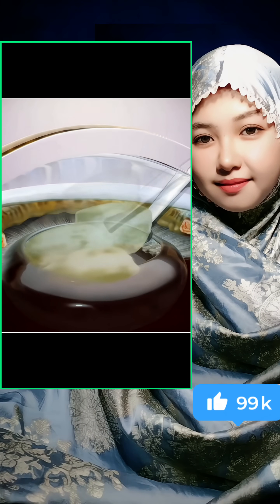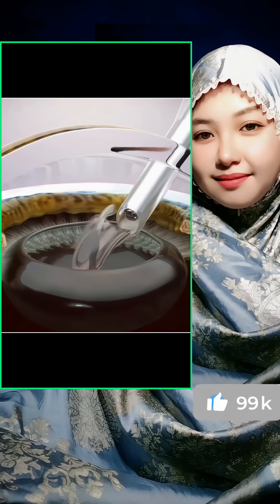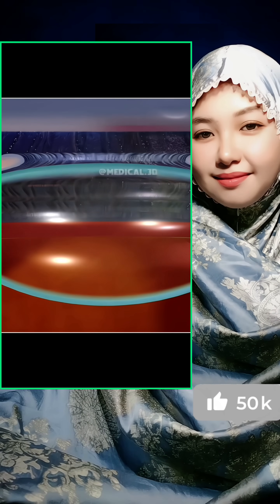Ever wondered how doctors remove a cloudy lens from the eye to turn blurry vision crystal clear? Cataract surgery is needed when the eye's natural lens becomes cloudy and blocks light.